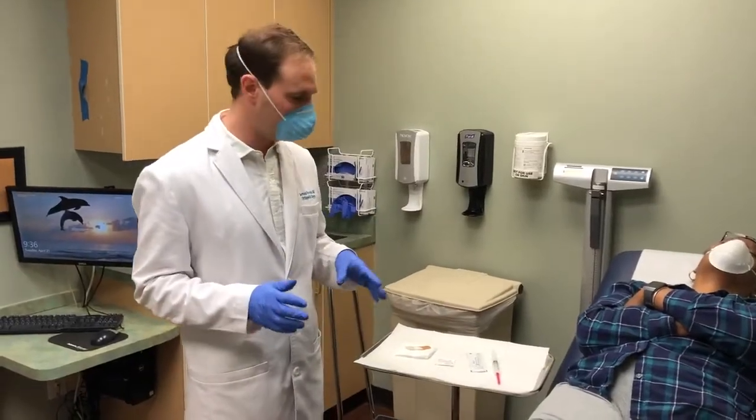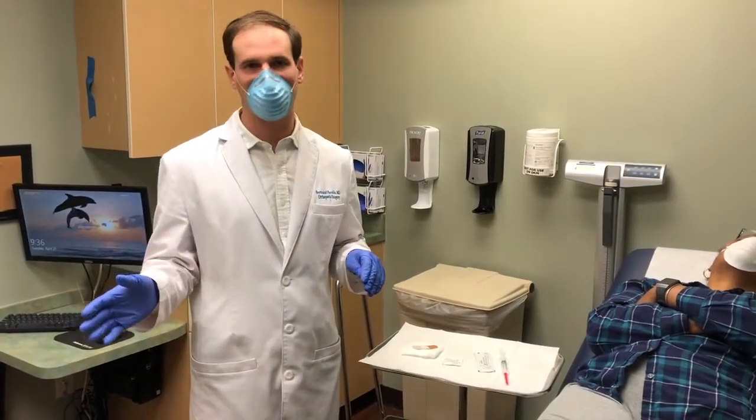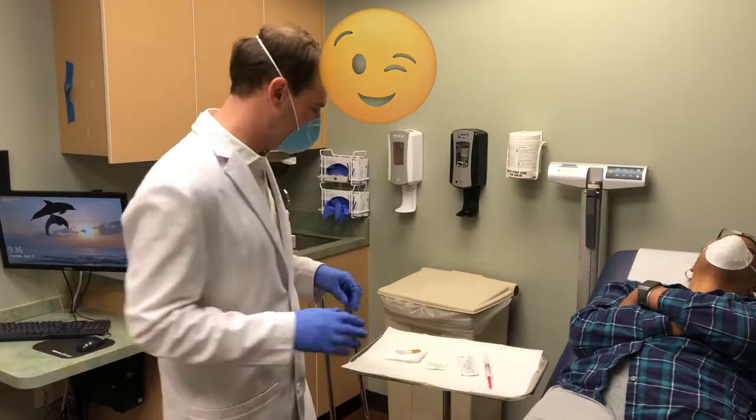Now we are ready to give the injection. There are a couple of steps: first we have to sterilize the site of injection, then we get the ultrasound machine set up, and then we give the injection itself.